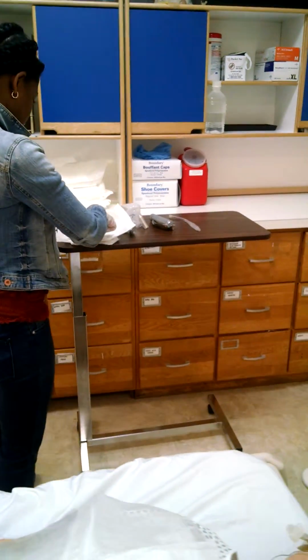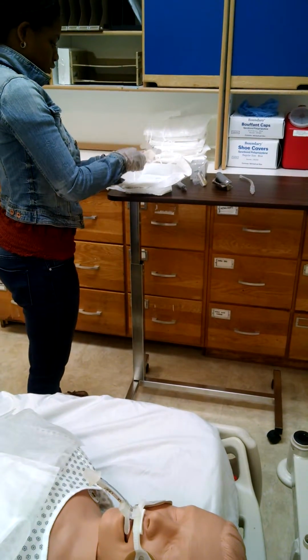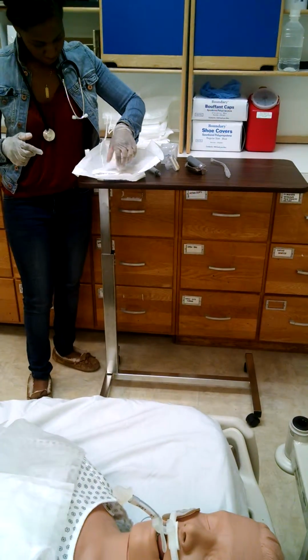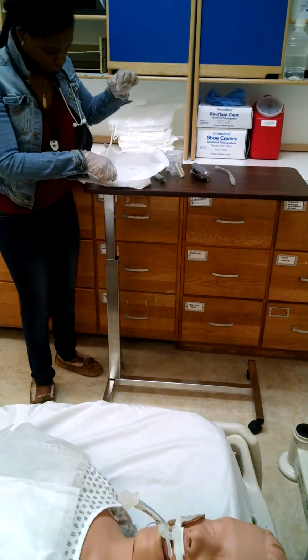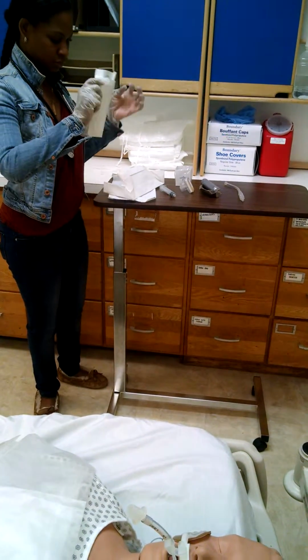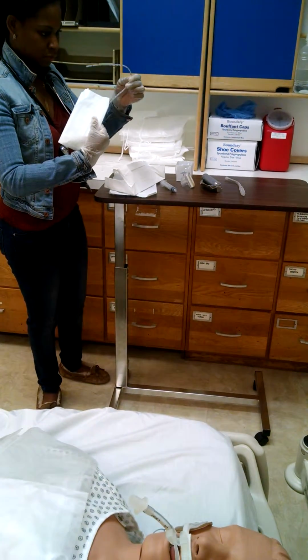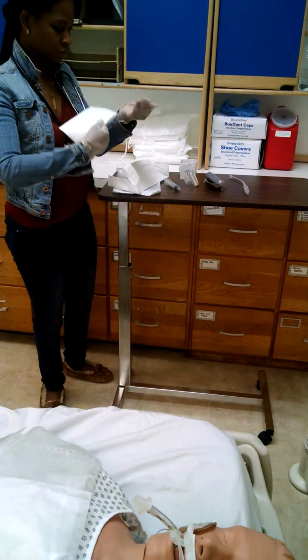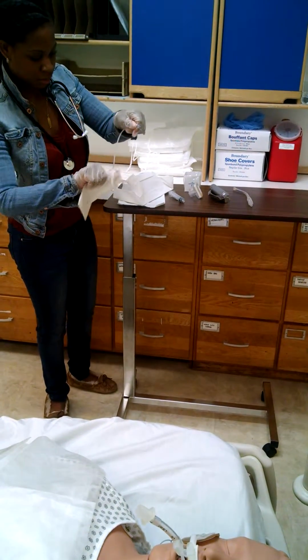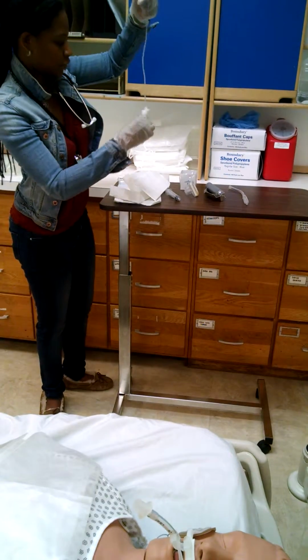Let's go ahead and... this is my dirty hand. This part can touch with the dirty hand, so I'm going to go ahead and grab it.